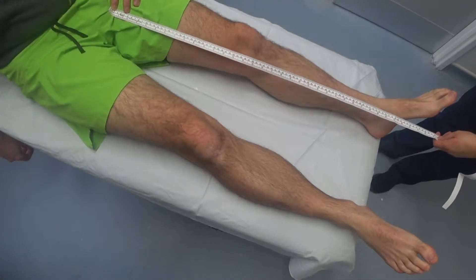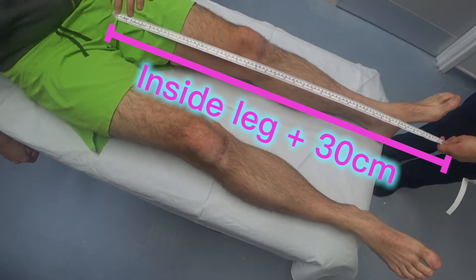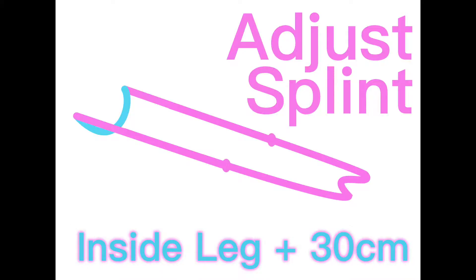It's important to set the Thomas splint to the right length. First, measure the patient's inside leg on the unaffected side, then add on 30cm or 12 inches. Adjust the Thomas splint to the determined length, also adjusting the hoop to the desired angle.